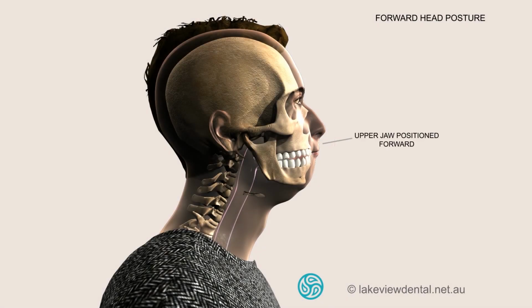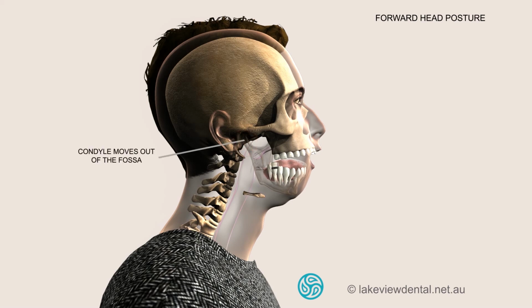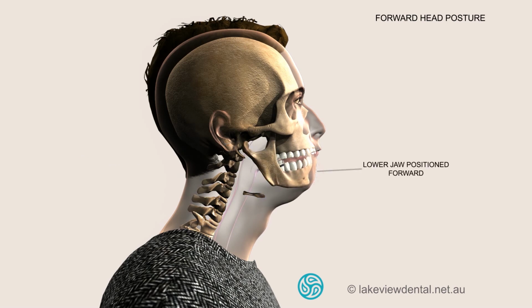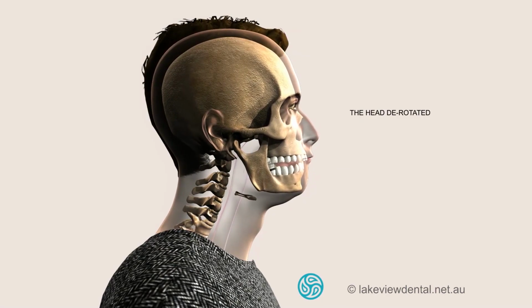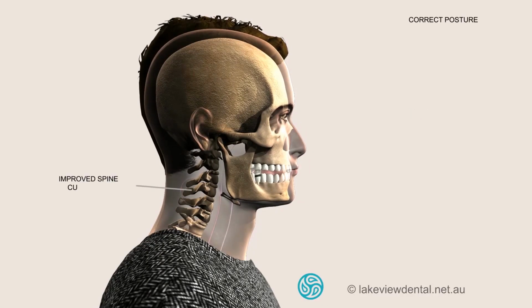Changing the upper jaw position can influence the airway. Moving the top jaw forward with a forward Dental Orthopaedics appliance in a gradual way and placing pads on the bite surfaces of the lower back teeth results in a few changes. The condyle of the jaw joints move forward and down as the lower jaw is moved gradually forward in sequence with the top jaw. This allows for a more forward tongue position away from the airway and in turn for the gradual derotation of the head with a better spinal alignment.